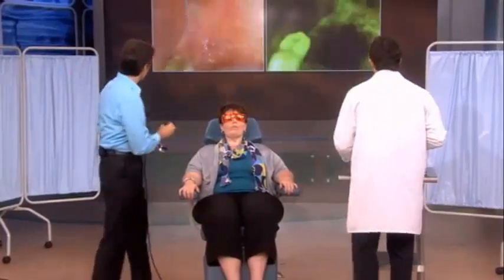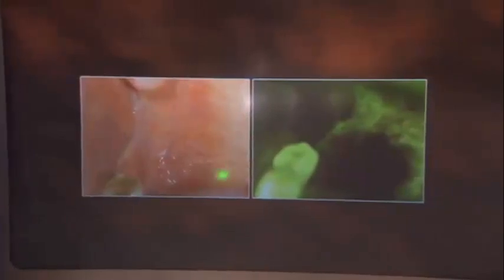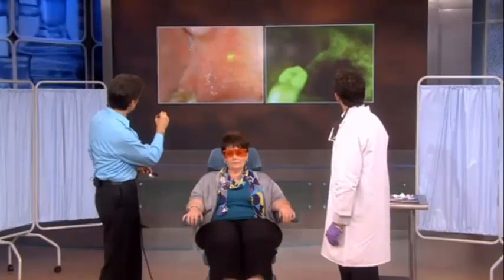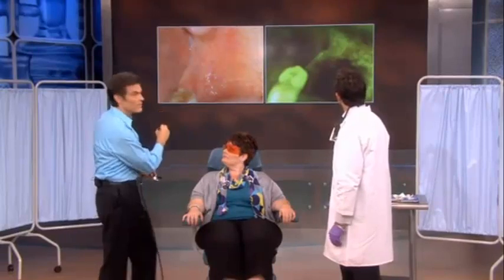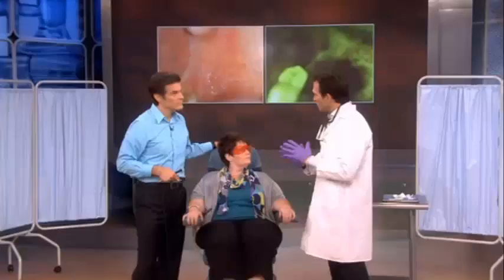Here's the picture that we would have gotten normally. This is a normal eye view. It's just, tooth is here, and you don't see anything too abnormal here. But notice this area looks a little bit indented. Look what happens in the velscope. Instead of the normal green, you have that darkened area. So you all see that? Yeah. So it's very helpful to aid the eye in identifying that as not being normal. Exactly. And when you see that dark area, when the clinician or the hygienist sees that dark area, now we know that we have some tissue that are dysplastic or even precancerous or even worse, and we know we have to take action.